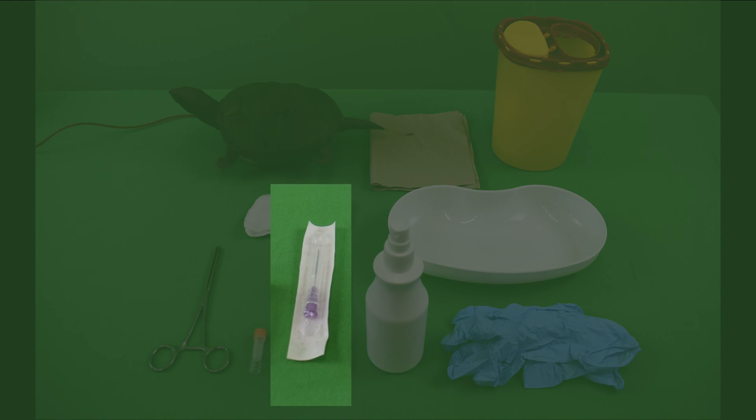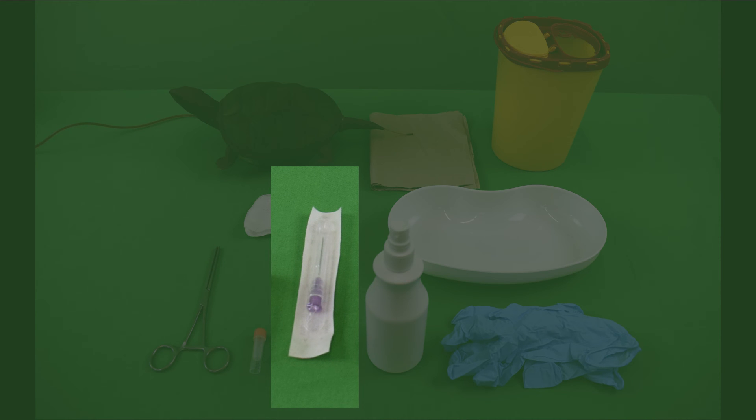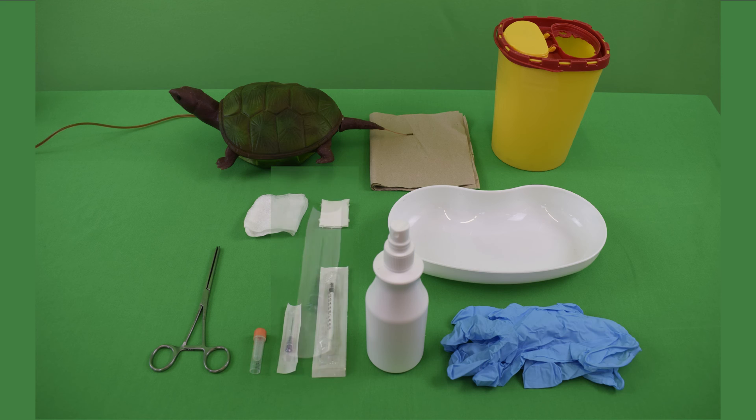Note: a rather large volume cannula should be chosen, as the relatively large nucleated erythrocytes in the blood, along with the low blood pressure and rapid coagulation in reptiles, collectively tends to lead to blood clogging up the cannula within a very short time. In addition, reptiles' veins are always punctured blindly without raising them.